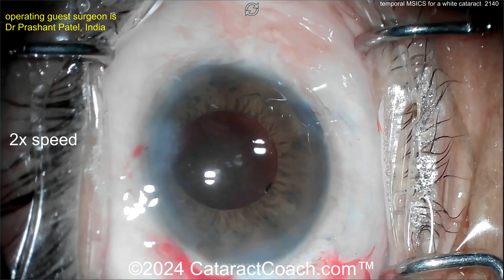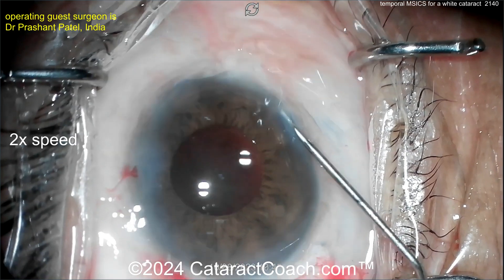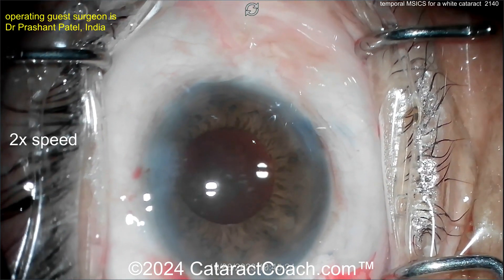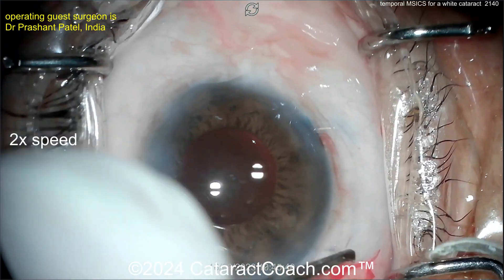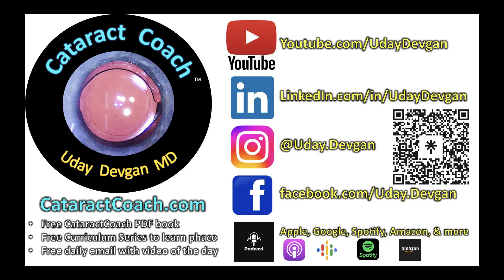The main incision is already closed. Now closing up the conjunctiva — maybe a little medication going inside the eye, some antibiotic, and a little more hydration. To close the conjunctiva you can use a suture or cautery. In this case it's going to be totally sutureless — a little bit of cautery closing it up. Beautiful, very nice case. Check out the cataractcoach.com podcast — it's every Sunday, everywhere you find podcasts. One podcast a week, so many great lessons to be learned.